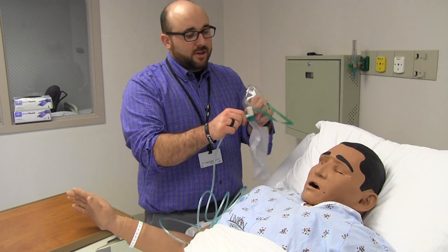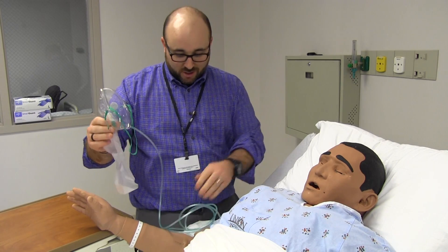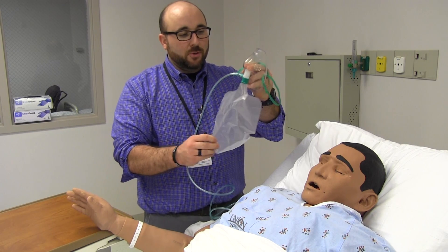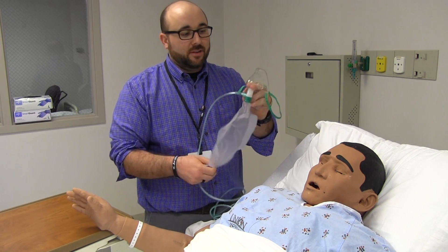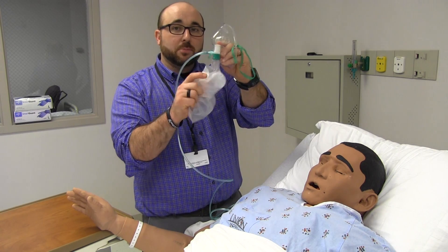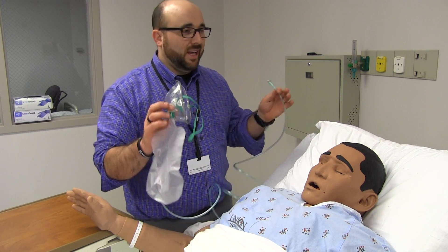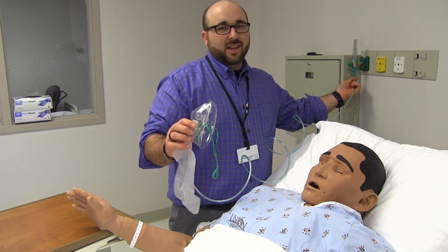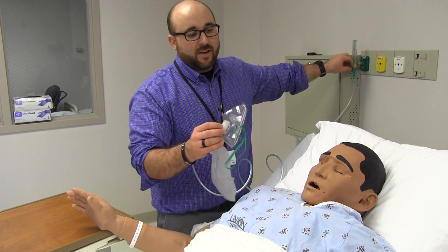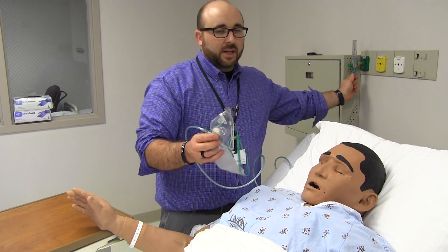The big one we see most often — used in EMS, the ER, or any place where a patient's getting ready to crash — is the non-rebreather. What this is all about is the patient will non-rebreathe their CO2, and they're going to pull 100% oxygen with each breath. We call it 100% that we're delivering, but in all honesty it's more like 80 to 90%. It's really hard to deliver 100% unless you have an endotracheal tube or a CPAP mask sealed on their face.